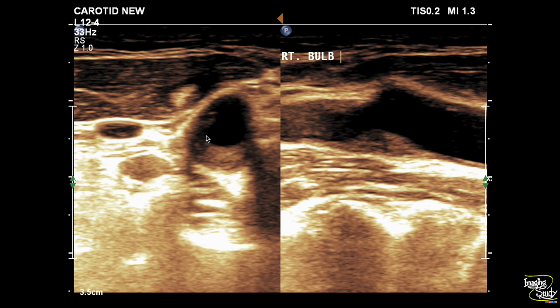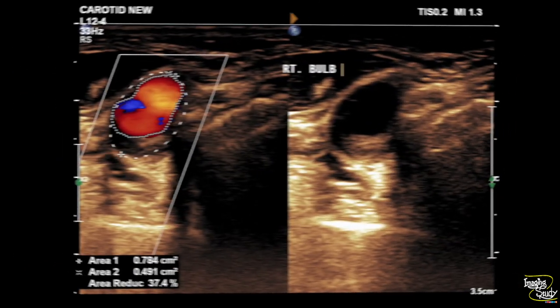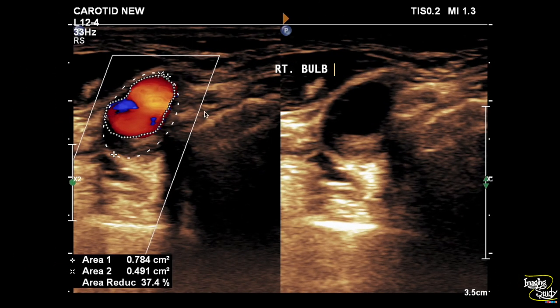This is the transverse and longitudinal section of the right carotid bulb. You can see a smooth-walled type 3 plaque — predominantly echogenic — at the posterior wall, causing mild luminal narrowing or stenosis. We have measured the stenosis and it was around 35 to 40 percent surface area reduction.